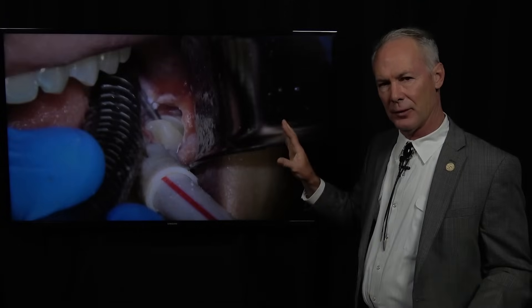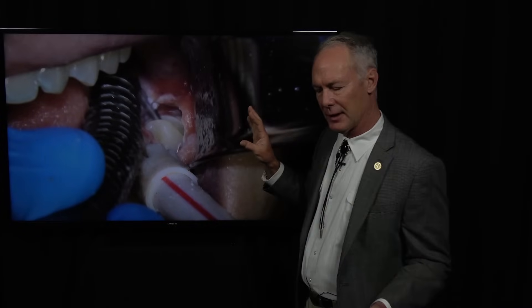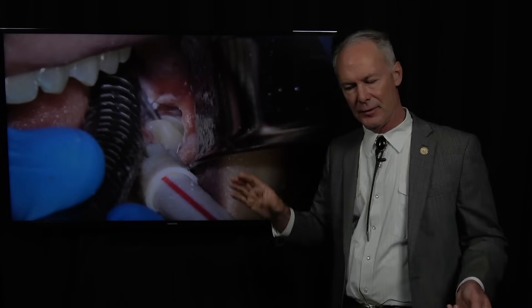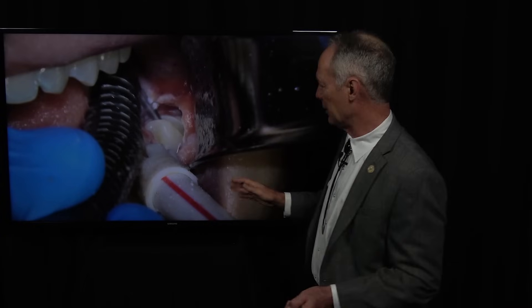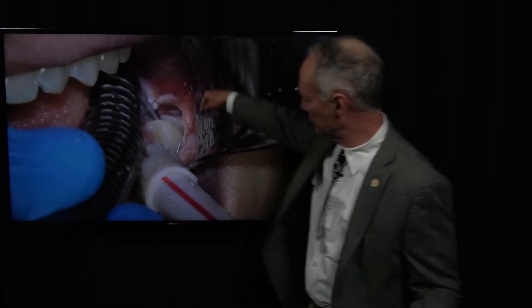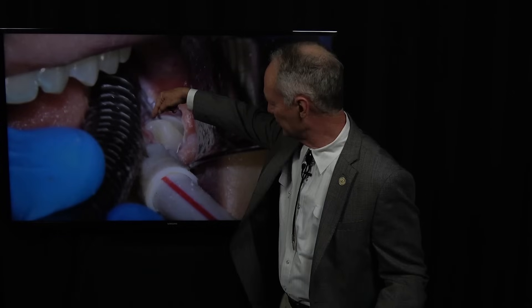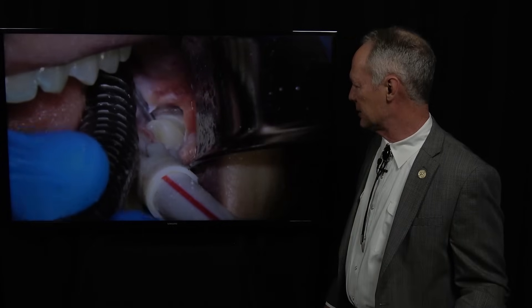So you want to measure on your radiograph ahead of time how far it is to the furcation, because we want to be extremely aware of the inferior alveolar nerve. We don't want to traumatize that nerve. We certainly don't want to cut the nerve. We don't want to get anywhere close to it. So I'm certain that I'm only going to the furcation of this tooth.